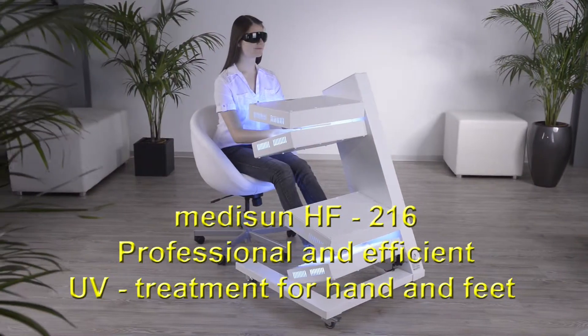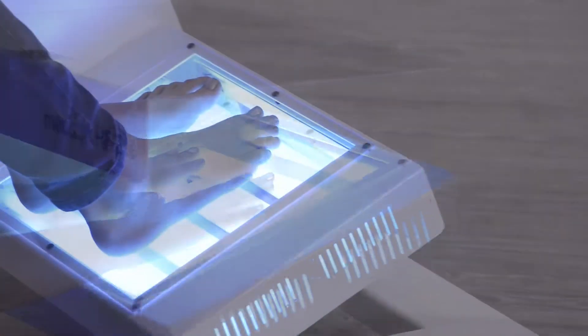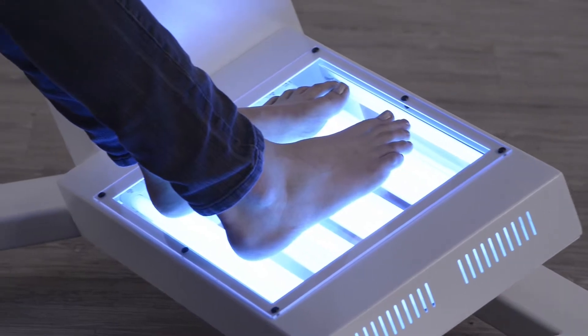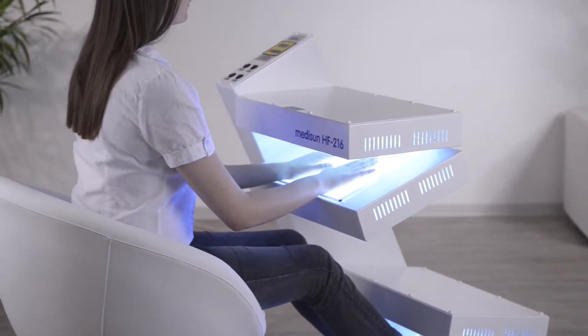MidiSun HF216 — the professional and efficient UV treatment for hand and feet. With MidiSun HF216, an effective treatment of psoriasis and other skin diseases is possible without any difficulties.